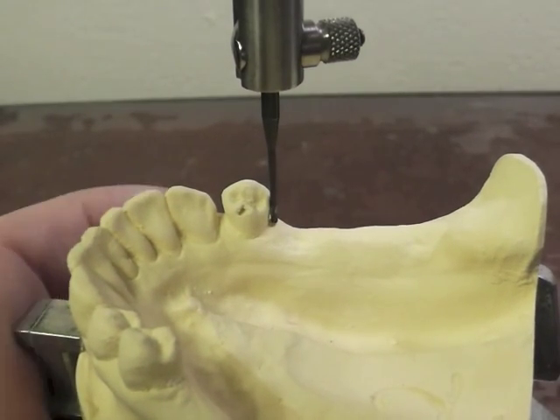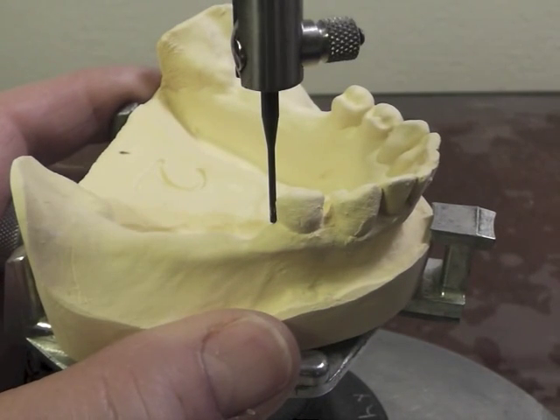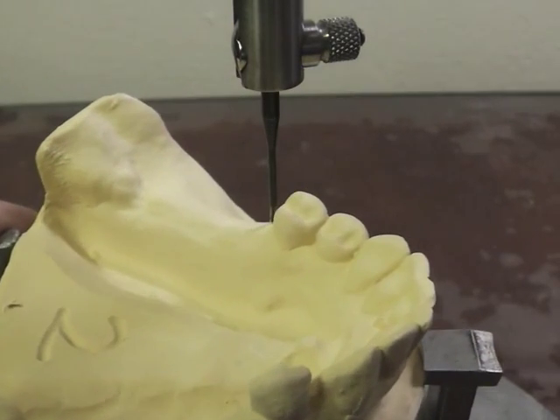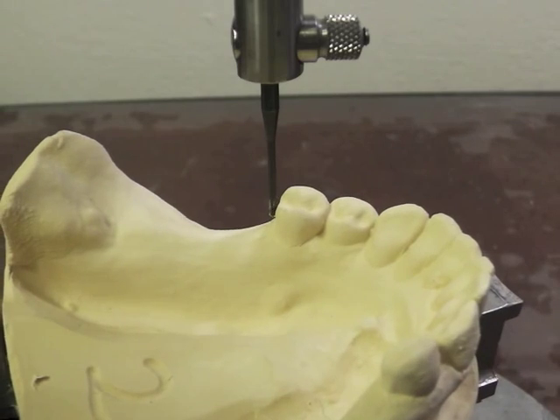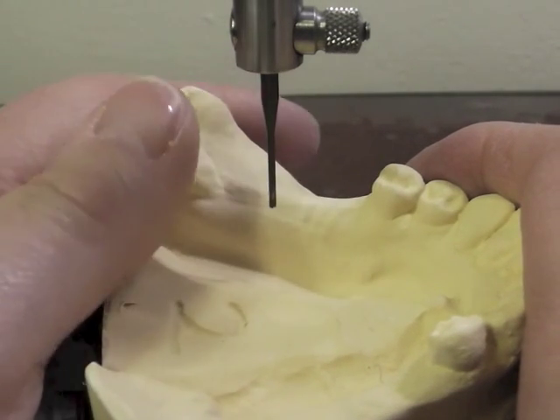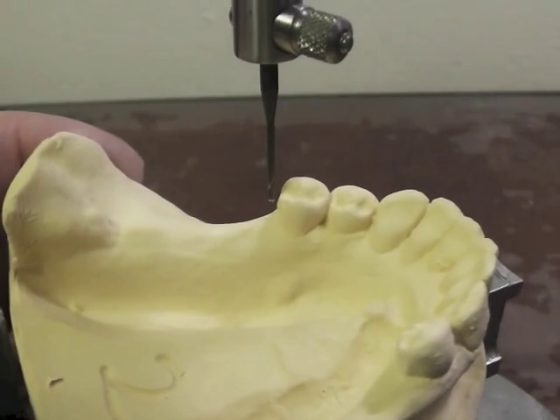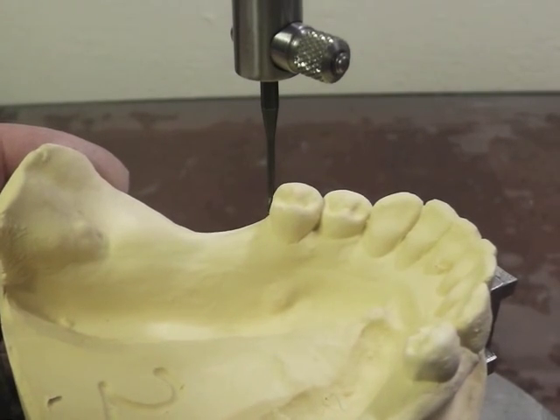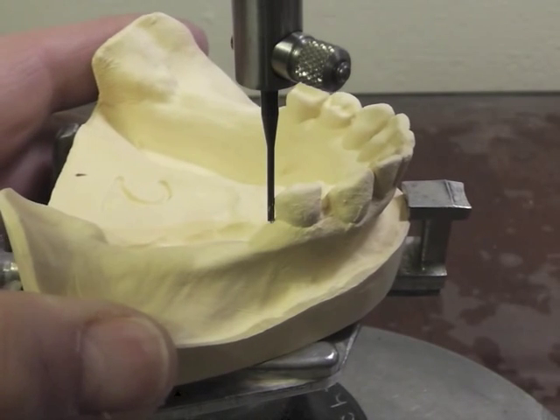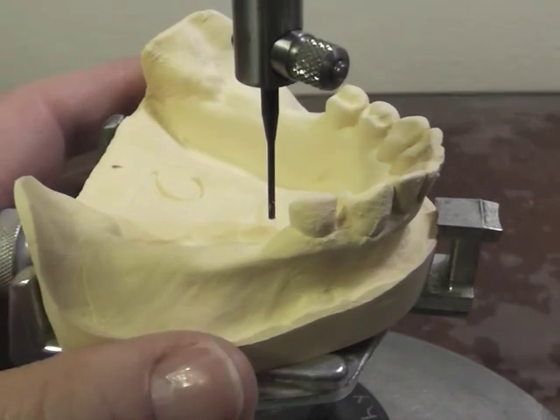This other side again looks relatively parallel at this position. So if I like that particular aspect of my survey, I could move it just a little bit in this direction to make this one a little more parallel. This one over here I might end up having to alter just a small amount, but it looks pretty good also.